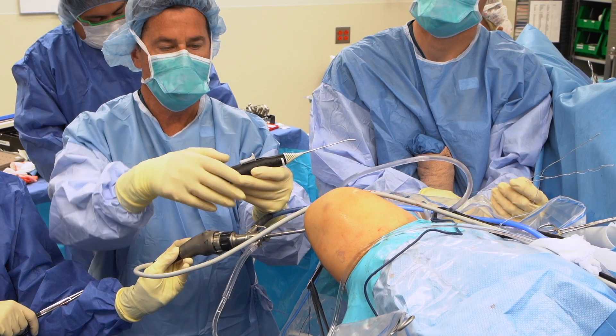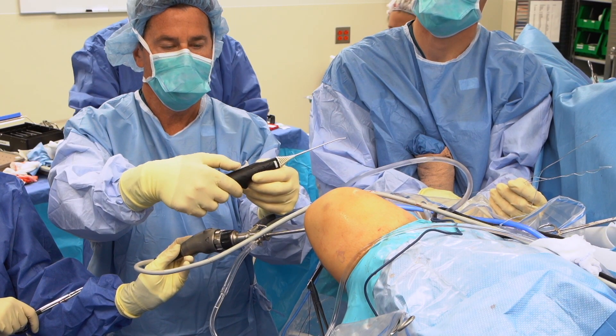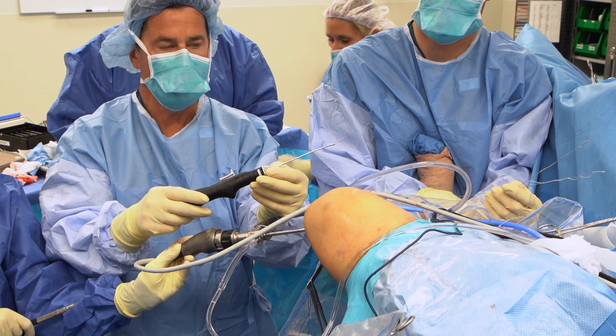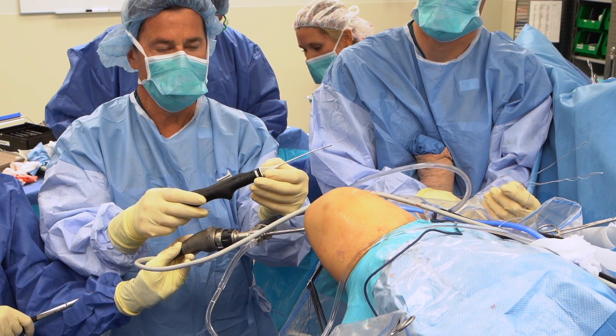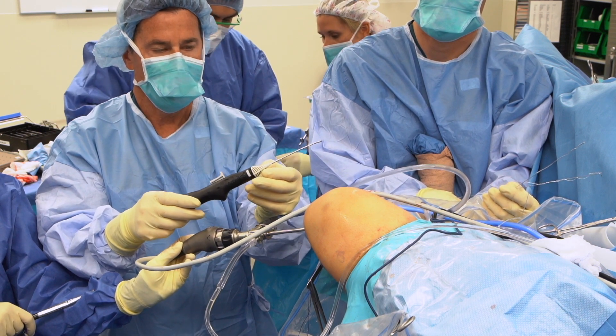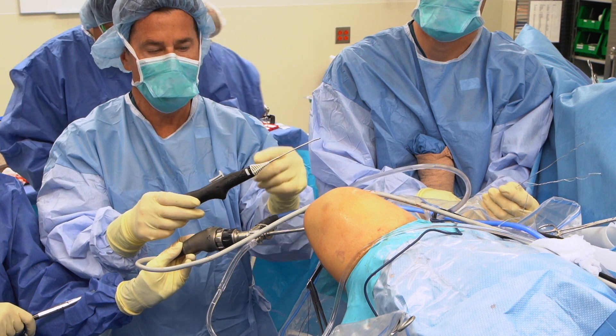The Zone Navigator basically has a thumb trigger that can advance the needle or retract the needle. It has three different cannulas: a posterior, middle, and anterior. Most times we can just use the middle, and the middle can flip over to use it as a left or a right.